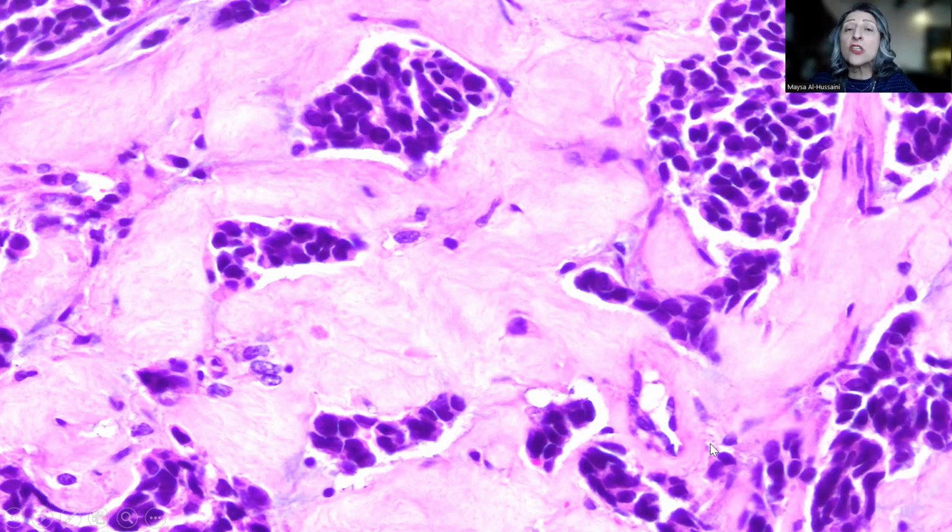And this appearance and the location of the tumor would raise a number of differential diagnoses, including different types of malignant salivary gland tumors like myoepithelial carcinoma, for example, or basal cell carcinoma, or even unusual tumors like neuroendocrine carcinoma, small cell carcinoma, or even desmoplastic small round blue cell tumor. However, it's very important if you have this diagnosis in mind, the Adamantinoma-like Ewing sarcoma, you will order the proper immunohistochemistry and you will reach the right diagnosis.